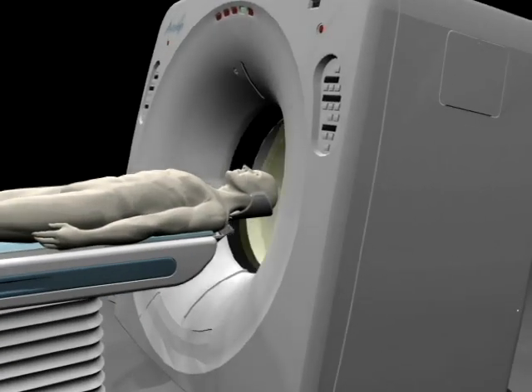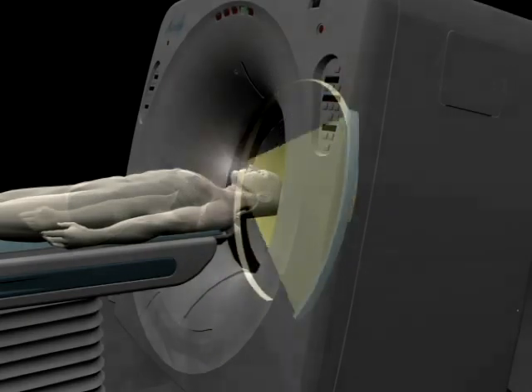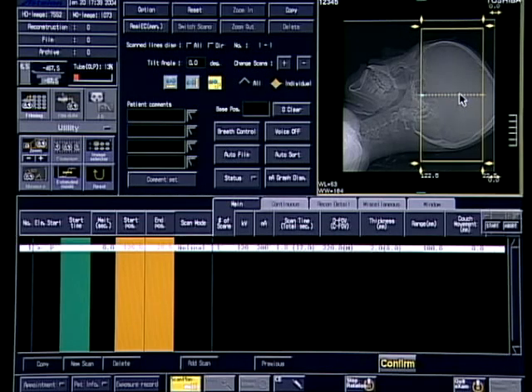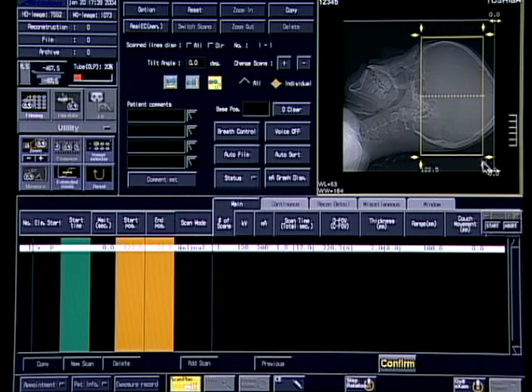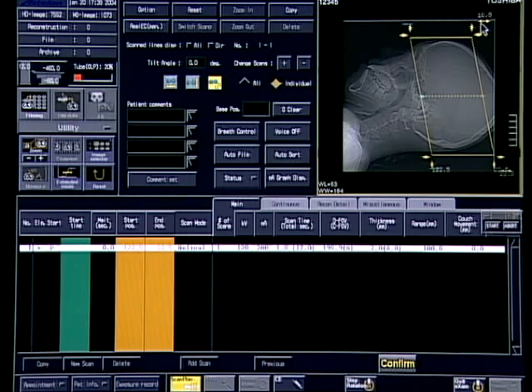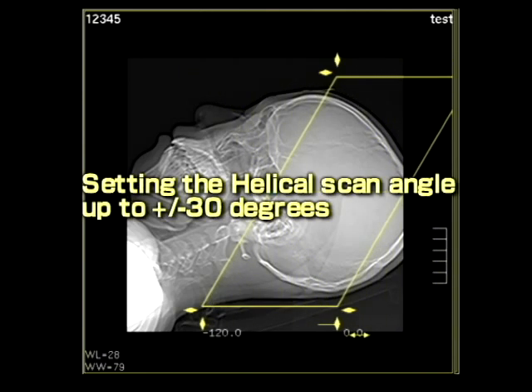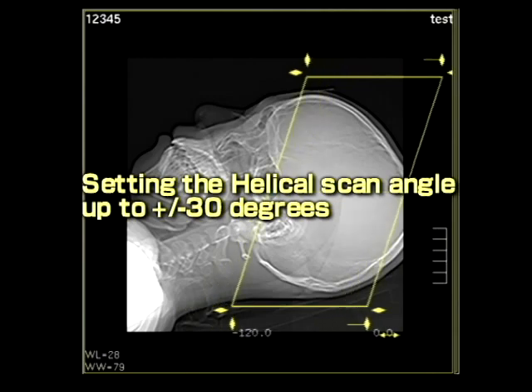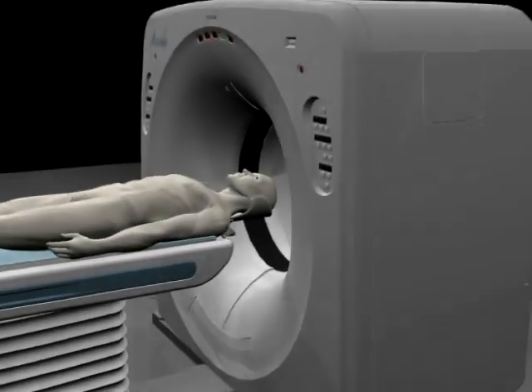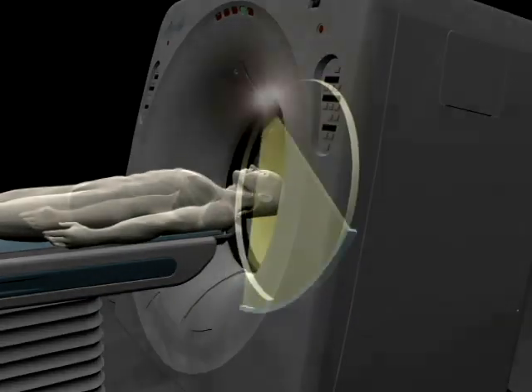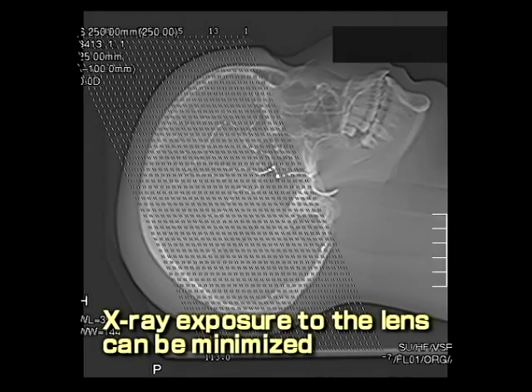Deterioration of image quality at a plus or minus 30 degree tilt is avoided by a unique proprietary algorithm developed by Toshiba. Tilted helical scanning is performed without exposing the eye's lens to X-rays. It also reduces the radiation dose by 20%.